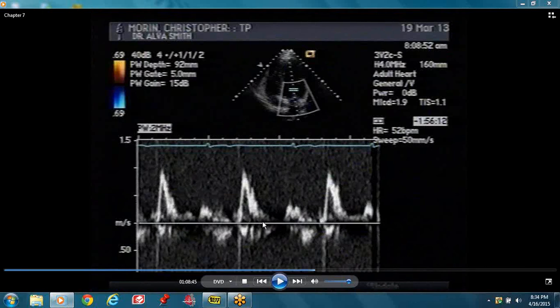You see your nice E-velocity and you get your small A-velocity. You have to position right midway between the mitral leaflets and the aortic valve. The position to get that nice picture would be your cursor point of interest about right here.